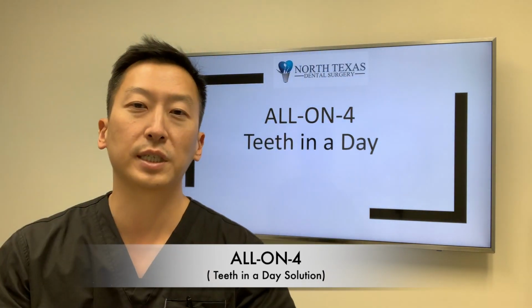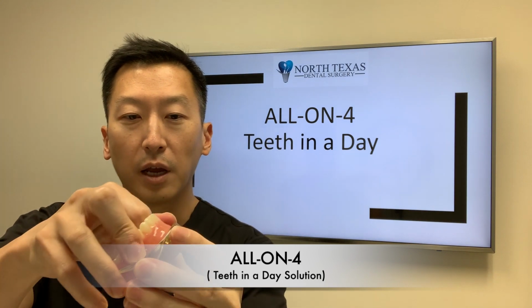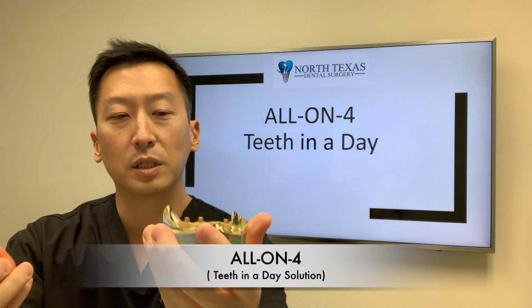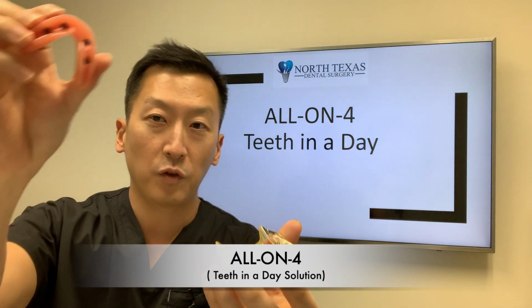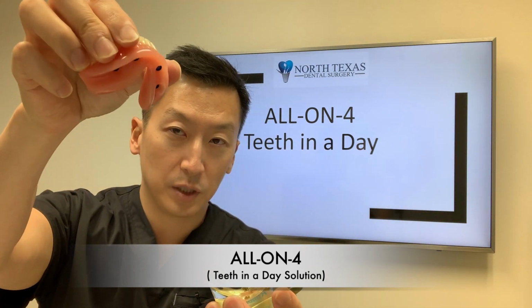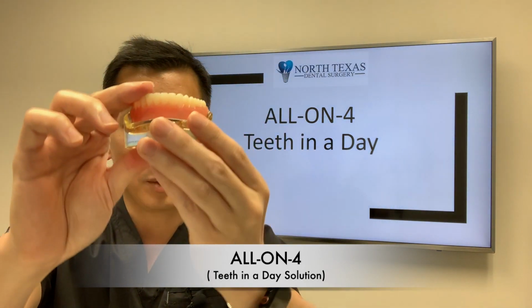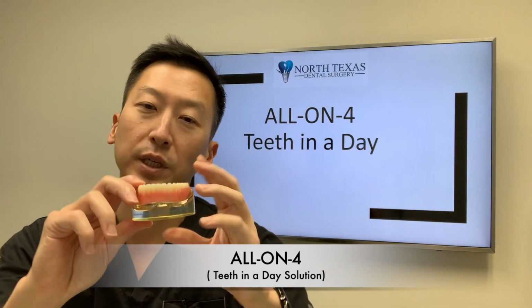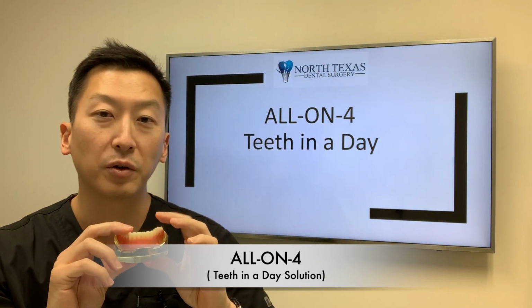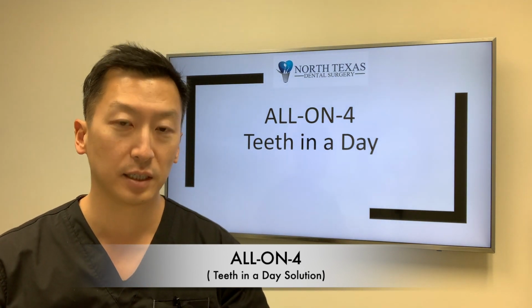The way that works is that we place dental implants within your jaw, and then we have prosthetic parts poking through your gums, and female attachments on the underside of the denture, which then allow the prosthesis to snap in place. Having them snap in place really resolves a lot of the stability and retention issues that the complete denture lacks.